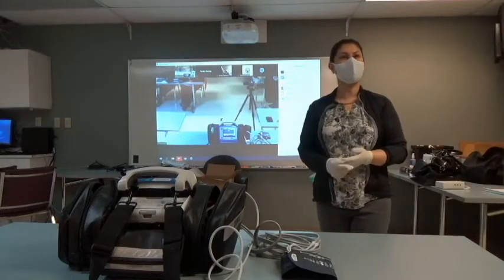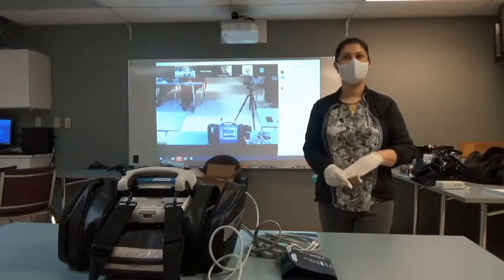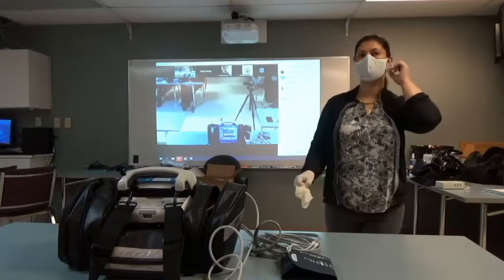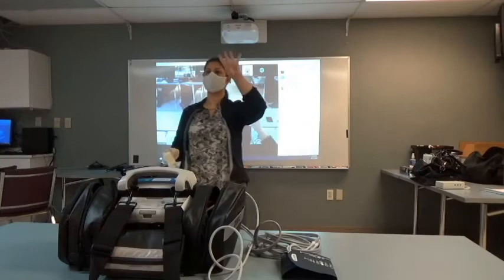Is anybody having a difficult time with the rhythm generator turning on? I only have three. Should we use this connection? Not yet. Just the four lead.